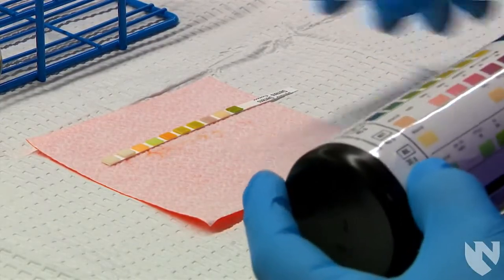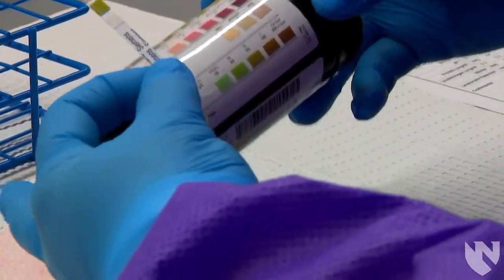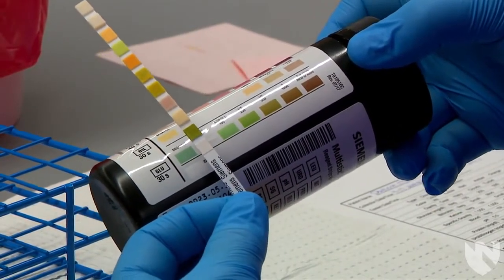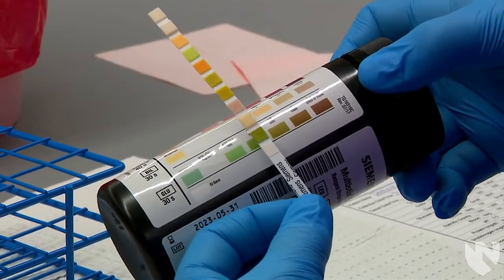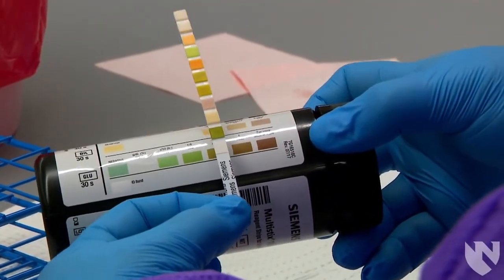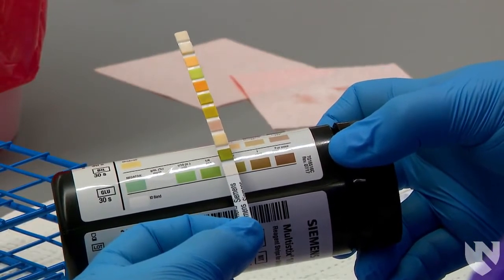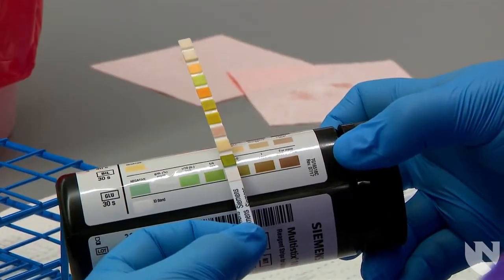Hold the reagent canister horizontally in one hand and the dipped reagent strip vertically in the other hand. Keep the reagent strip flat to prevent any chemicals from mixing. Do not touch the canister with the dipped reagent strip. The name of the chemical test and the time it must be read are on the far left side of the canister. The first two reagent pads, glucose and bilirubin, must be read at 30 seconds.